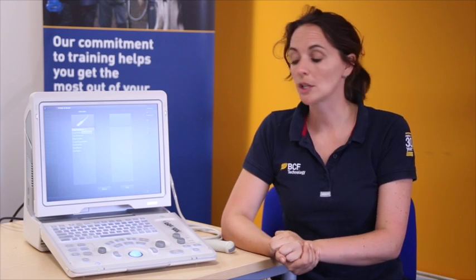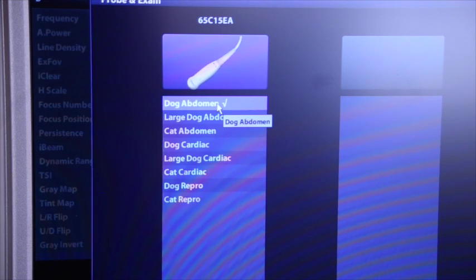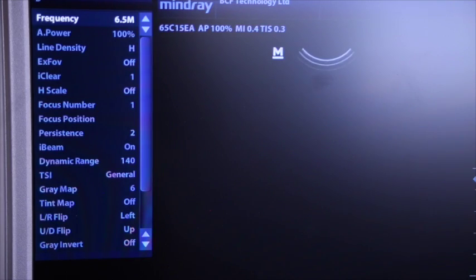The type of exam does dictate what measurements and annotation settings you have, so it's very important to choose the correct one. Once I've highlighted it, I hit set, and we're all ready to scan on the dog abdomen preset.